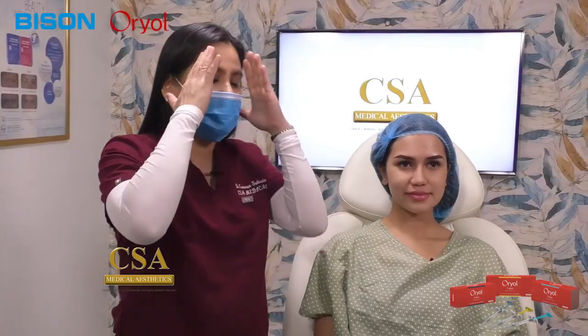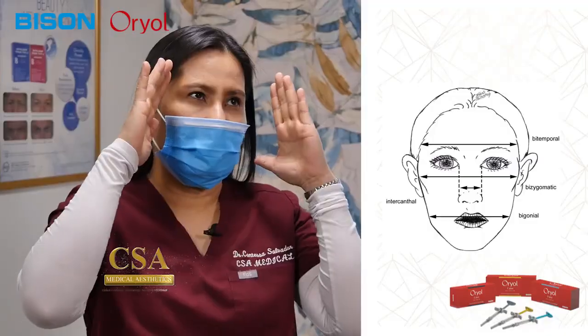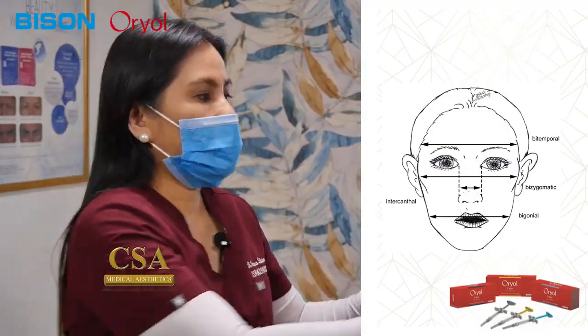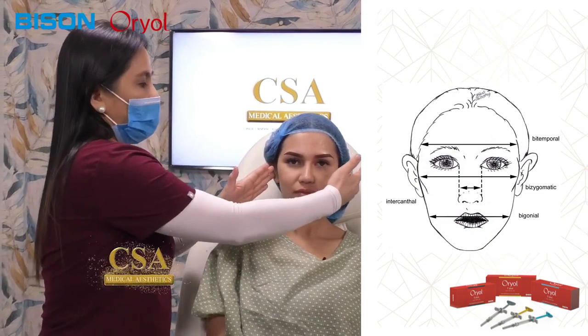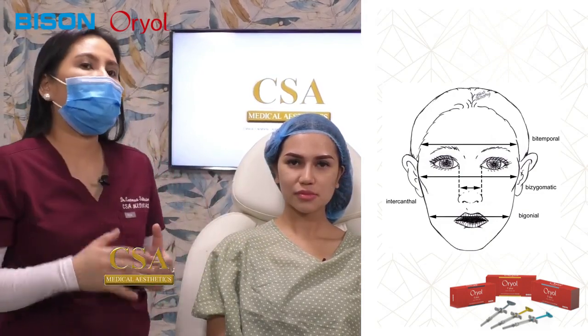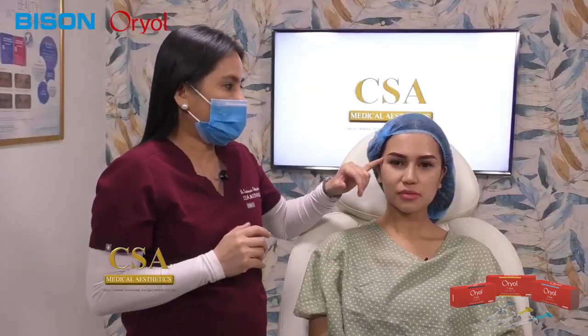Right? Yeah. So this part, Kim, ideally there's this normal fullness of that temple. For women, ideally we should have that good bitemporal width balanced with our bizygoma width. Okay, now if you're noticing that your bizygoma width is wider than your bitemporal width, then you're starting to have the so-called volume loss in your temple region.